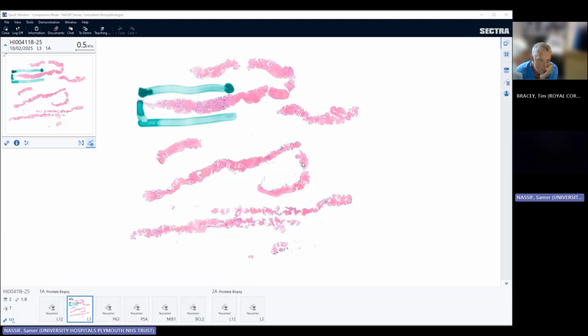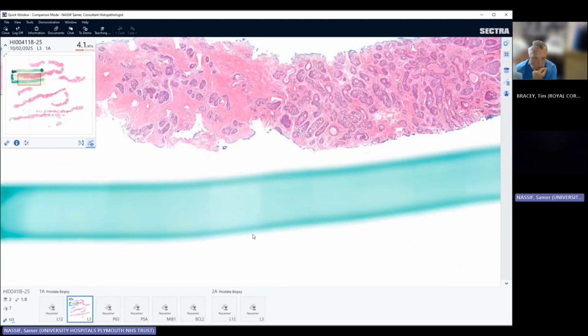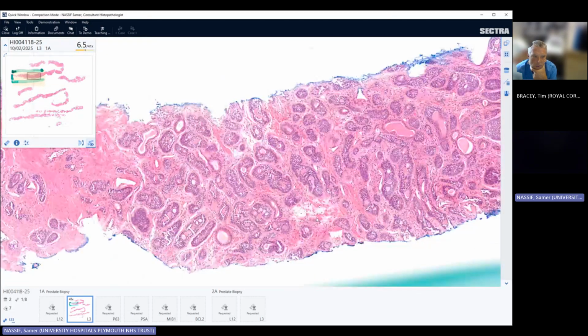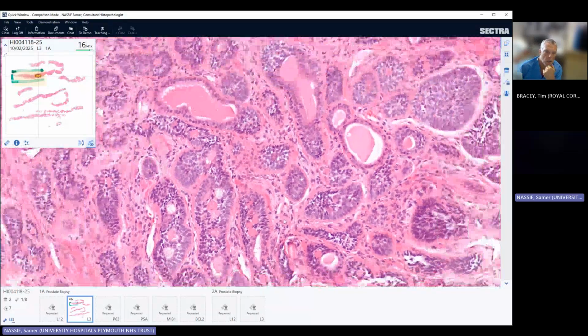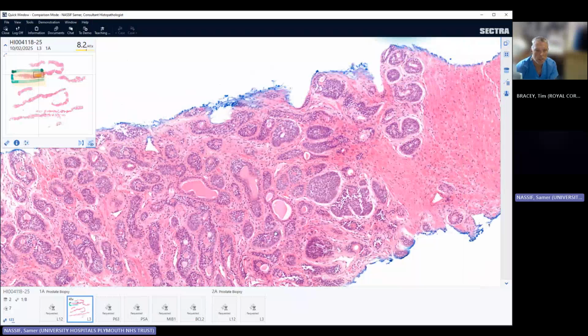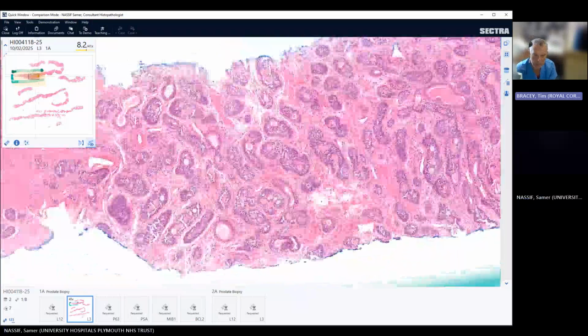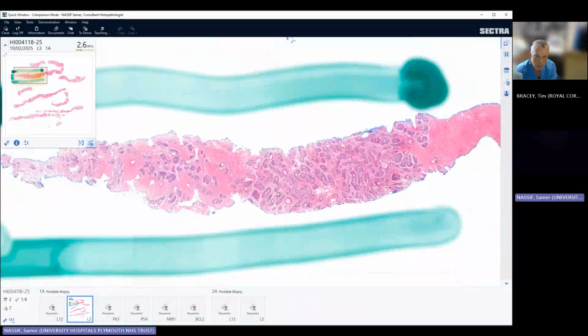Lesion on MRI, Likert 5/5, okay? This is the original biopsy that I reported. This was the only area that was abnormal looking. There's no cytologic atypia, no desmoplasia, no perineural invasion. There's no basal cell hyperplasia or something? That's what I called it, and it doesn't look really like an infiltrative process. So I called it basal cell hyperplasia based on that.